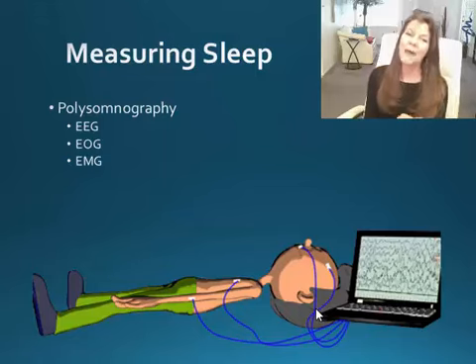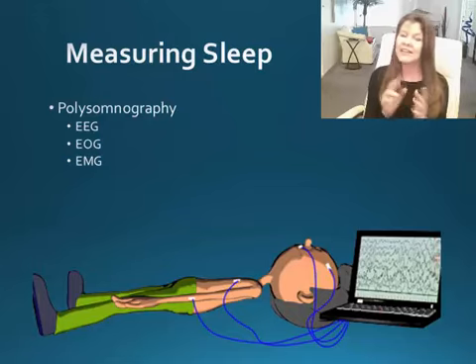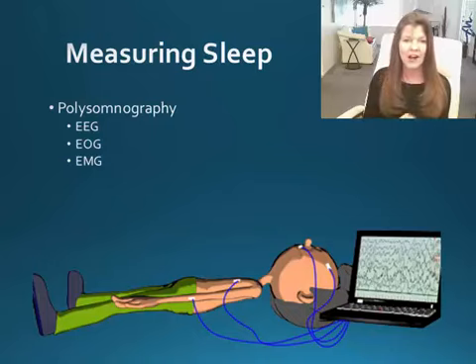A sleep lab produces a polysomnography, which records characteristics of the sleeper's sleep throughout the night. It generally has at least 2 lines of readout for the EOG, the electrooculogram, and this measures eye movements. At least one for the EMG, the electromyogram, which measures muscle tone of the chin and jaw, and at least one for the EEG, electroencephalogram, which of course measures brain activity or brain waves.